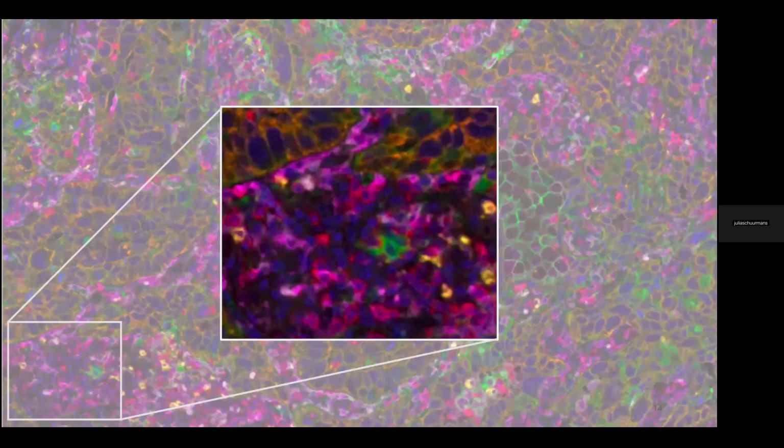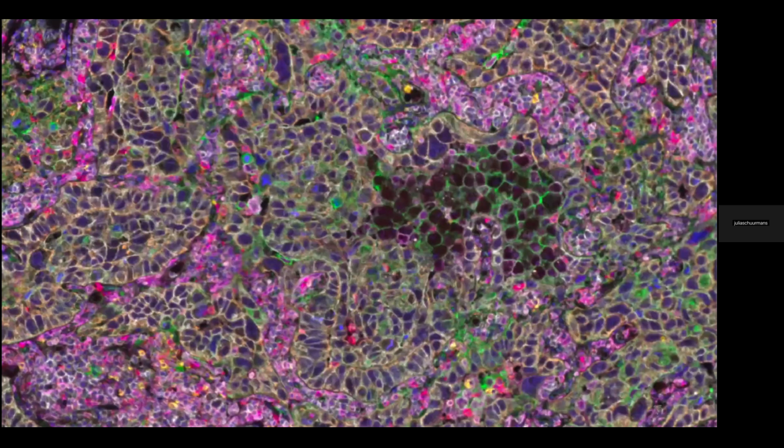We look down that bottom corner there, we see that there are a lot of the dark DAPI nuclei, but there is nothing tracing them. There's no staining. These cells do not have a membrane marker on them. They will not be picked up by our image analysis software. So just to highlight them there. Does everyone see what I'm talking about? They're missing? Lovely. So my job was to build a stain that will pick up on those.